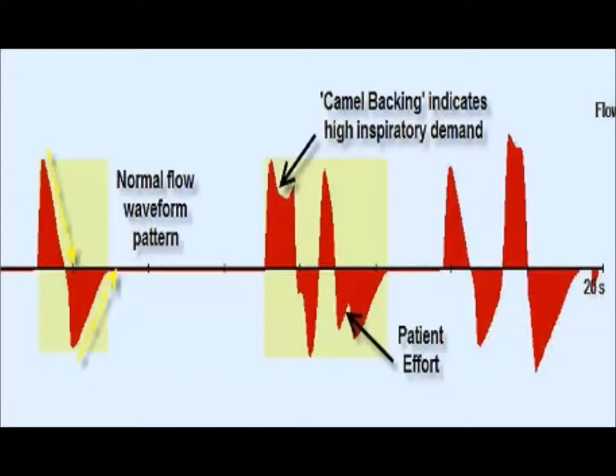And if the mode does not allow for this lower level of automation, it probably doesn't have a higher level of automation. And one of the things we look at is if the mode provides automatic adjustment of support to meet patient demand. And we're going to get more into this. I didn't present this in the first introductory video, but what this deals with is the inspiratory phase of the patient, that part of the breath phase, specifically with flow asynchronies.